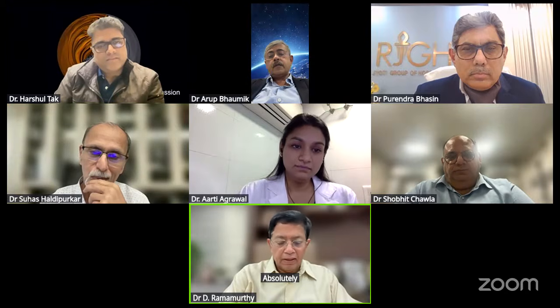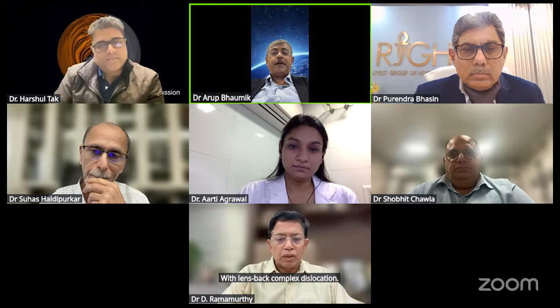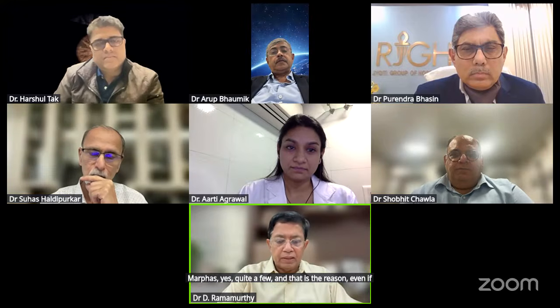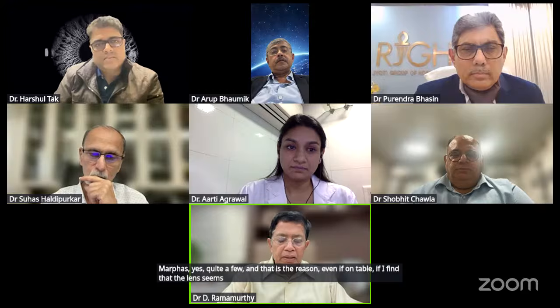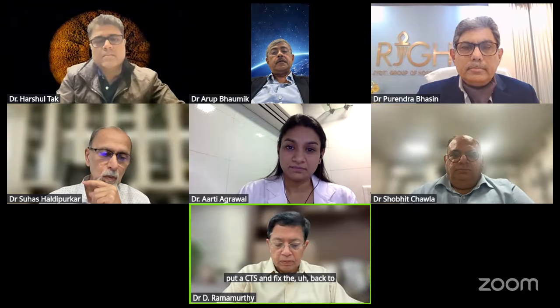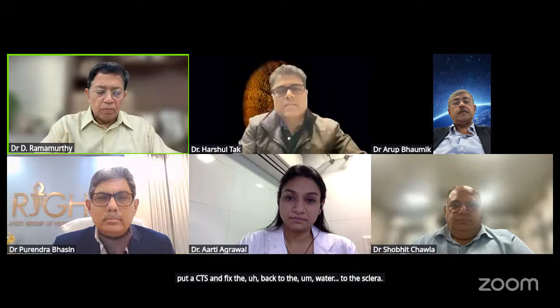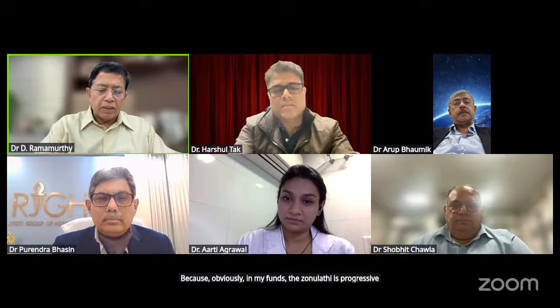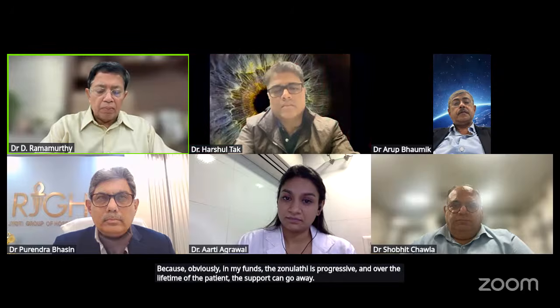Absolutely, Suhas. I have had this, plenty, sir, quite a few. I'm not talking about zonulopathies in general, but these specific Marfans. Marfans, yes, quite a few, and that is the reason. Even if on the table I find that the lens seems very stable and reasonably centered, I go ahead and put a CTS and fix the bag to the sclera, because obviously in Marfans the zonulopathy is progressive, and over the lifetime of the patient, the support can go away and the entire complex can drop down.